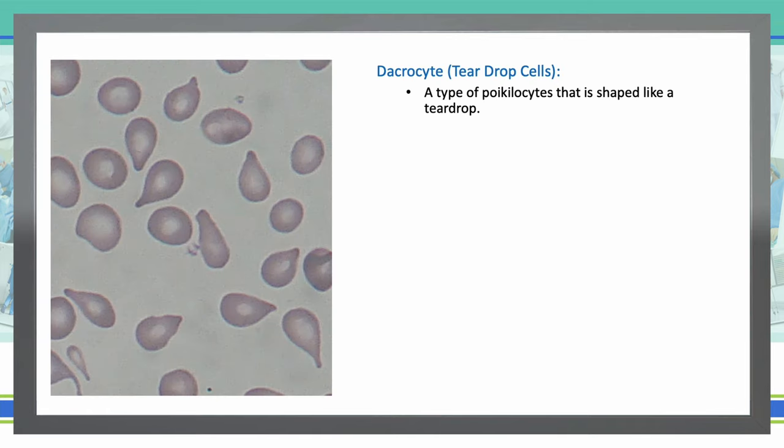Next, we have teardrop cells. Teardrop cell formation is that RBCs containing various inclusions undergo pitting by the spleen to remove these inclusions. And in the process, they can be stretched too far to return to their original shape. It is also thought that this can similarly occur when RBCs with large inclusions are obstructed from passing through the microcirculation and the portion containing the inclusion gets pinched, leaving a tail end. So you can see that over here, the tailed end.